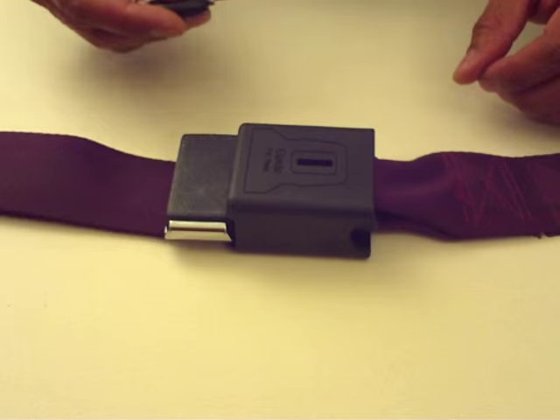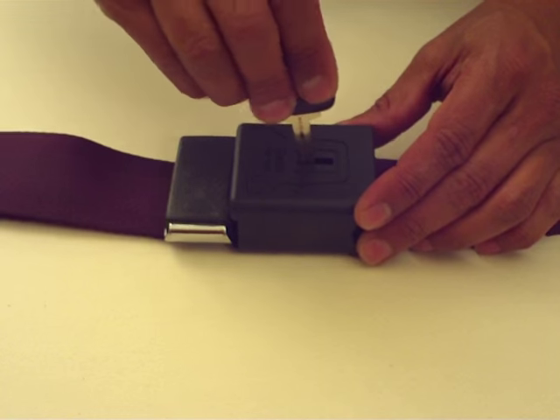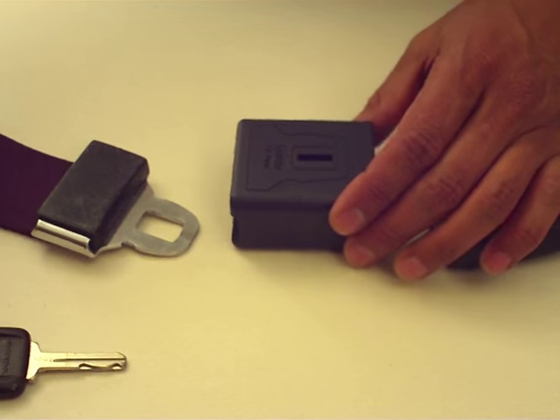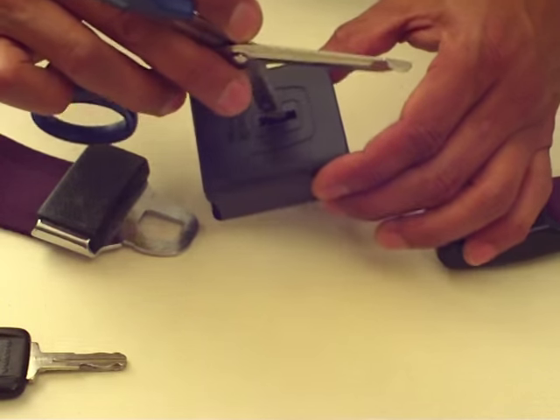The buckle guard is released by pushing a standard automobile key through the slot. The buckle guard can also be released with a trauma shear blade or similar device.